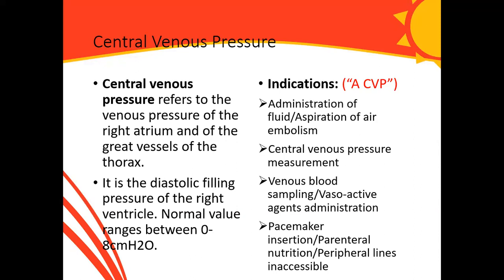You can actually do your pacemaker insertion through your central venous catheter already inserted, and parenteral nutrition can also be given through your central venous catheter. And sometimes you have patients who are completely burnt and there is no peripheral line. A CVP in this patient is indicated.